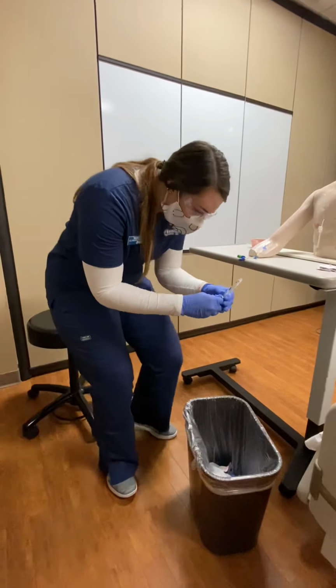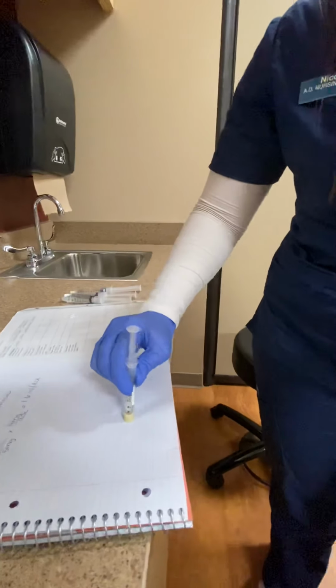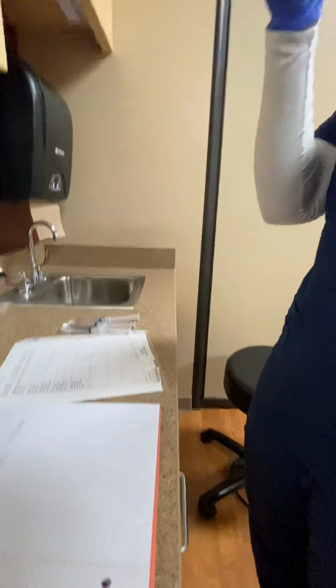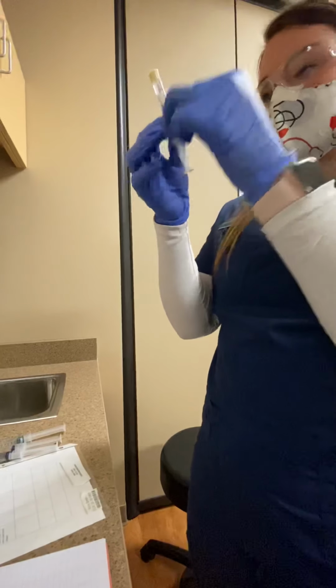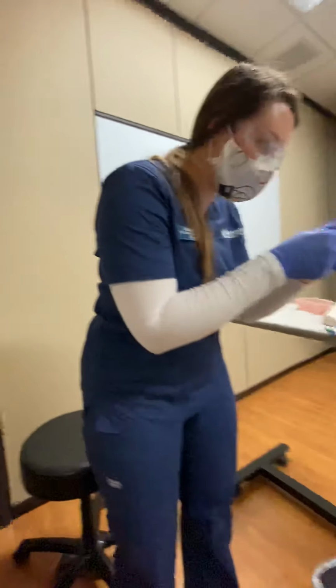Okay. There are some bubbles in there, but I can't get them out right now, but I would. Without contaminating, put the cap back on. I just need to get rid of just a little bit.